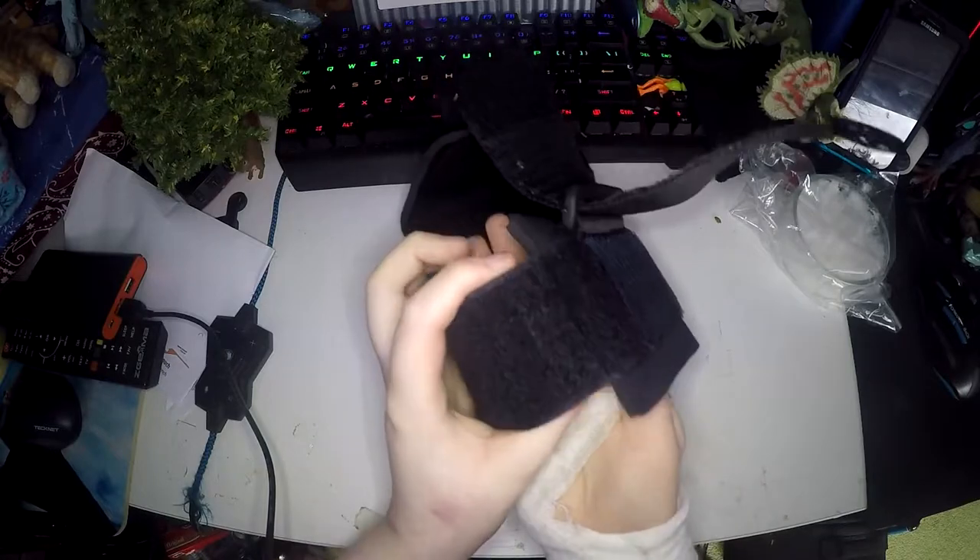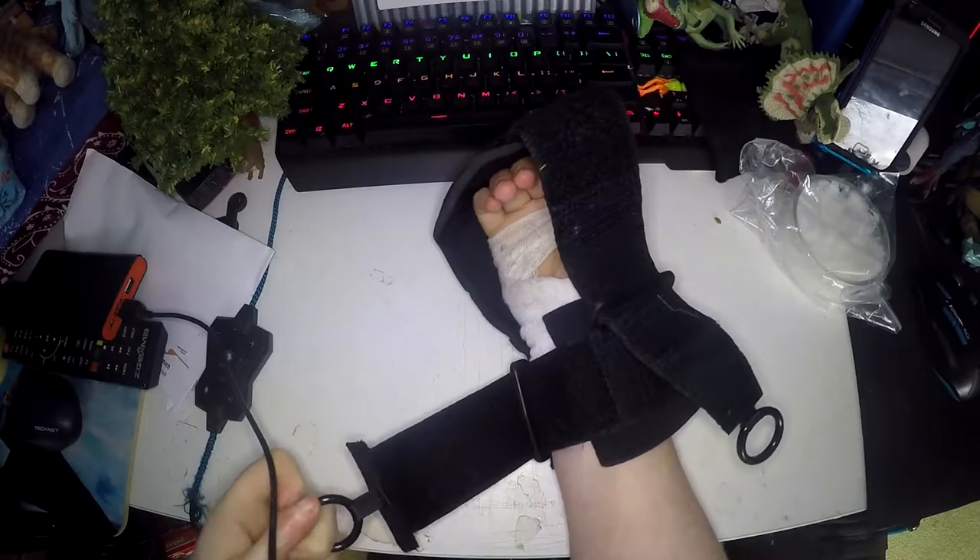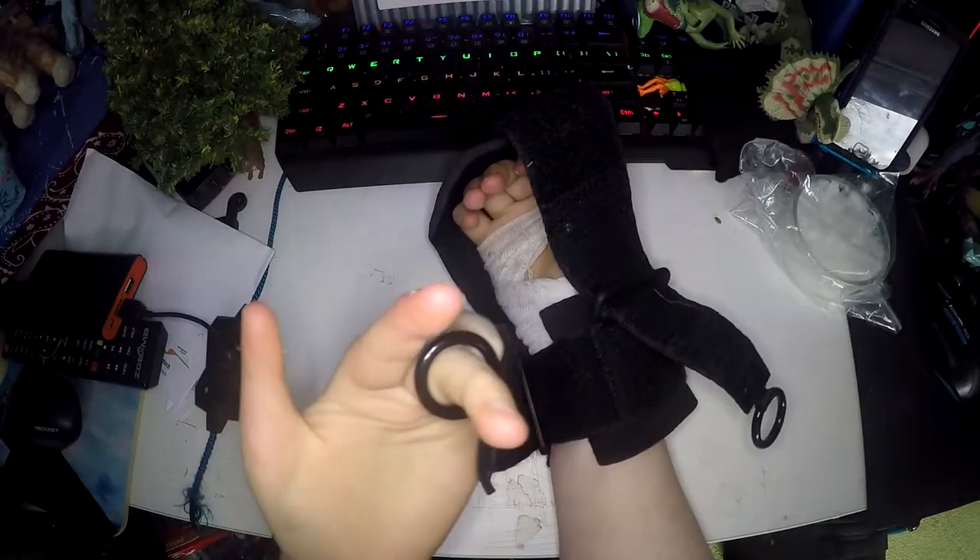What you do is you put your hand in the bottom here so it is up there and then tighten it. You can put your finger through the loop so it's really easy.